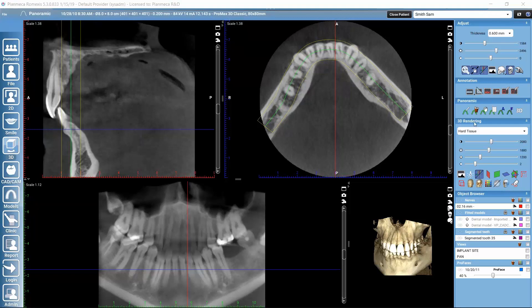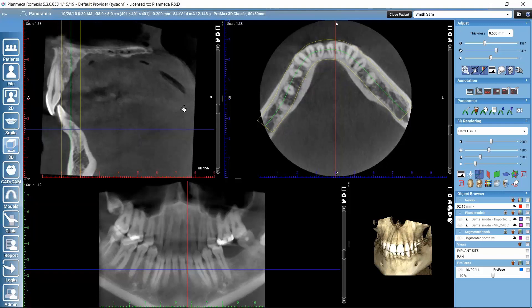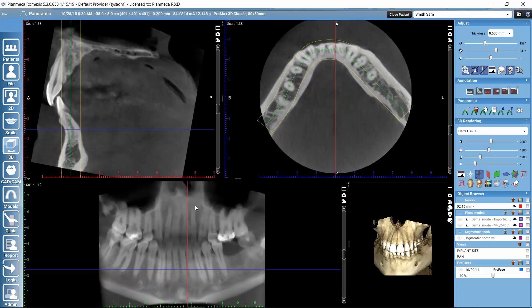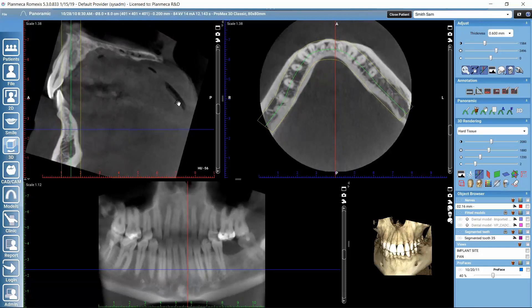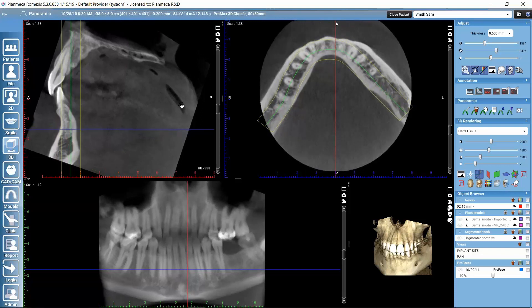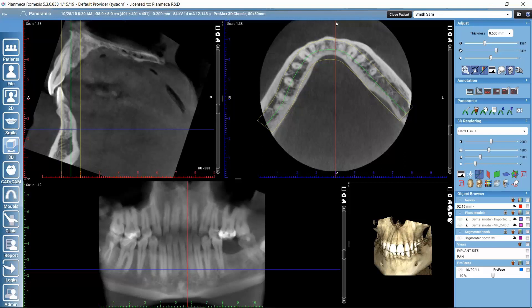Let's continue adjusting our panoramic view. All the normal controls apply to these slice views as well. With the move/rotate volume active, we can grab this view with the right mouse button and adjust the curvature of the panoramic view — for example, to fix the occlusal plane so that it looks straighter. If we need adjustments to the coronal view, that's not directly available here in the panoramic sub-module, but those adjustments can be made in the Explorer sub-module.